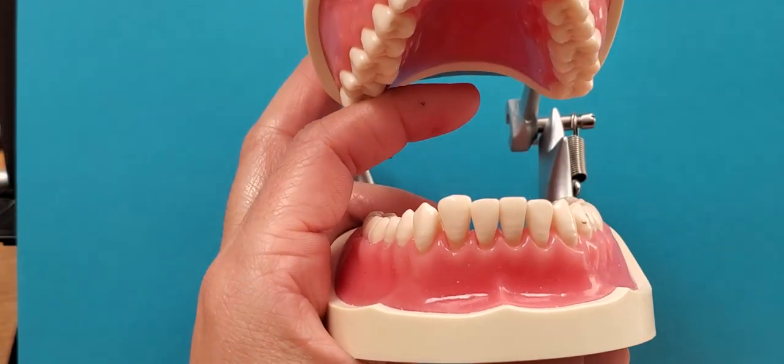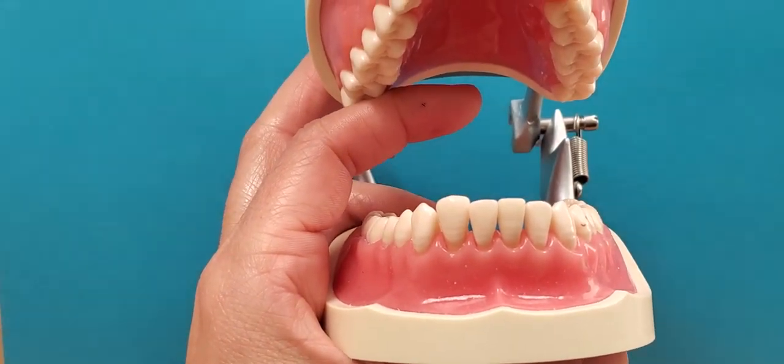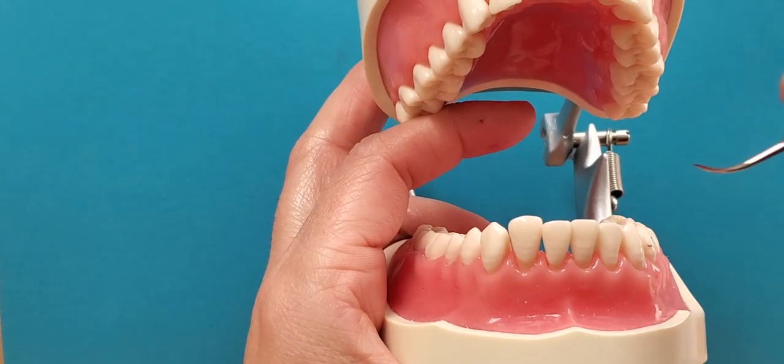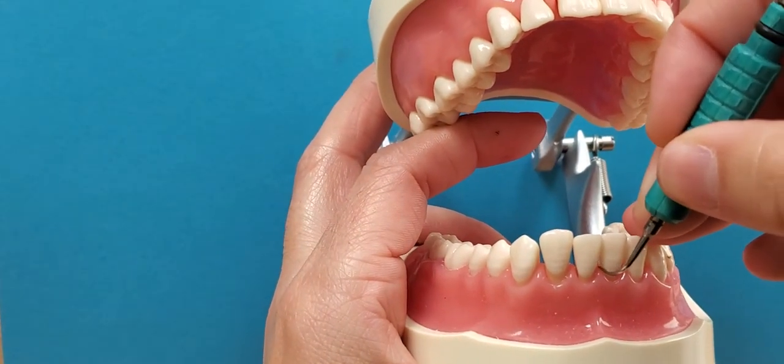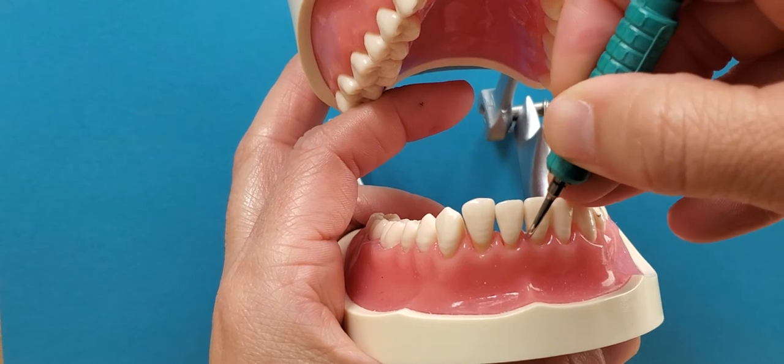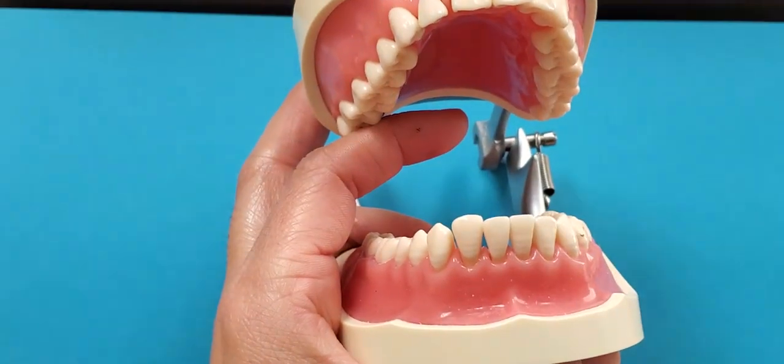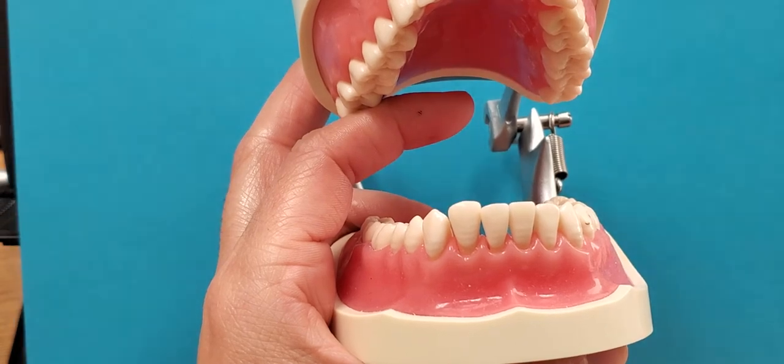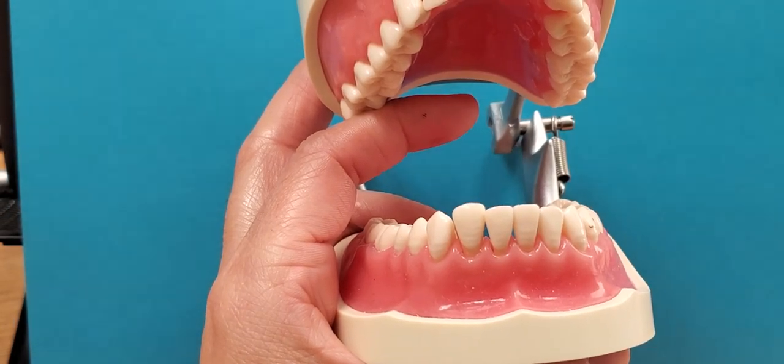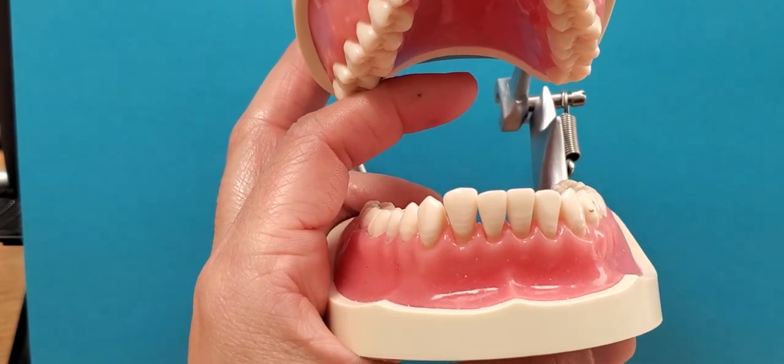Just like with probing and with using curettes, your patient operator positioning for curette style does need to change for towards and away surfaces. For probe style you do not need to change your patient operator positioning just like you don't with probing.